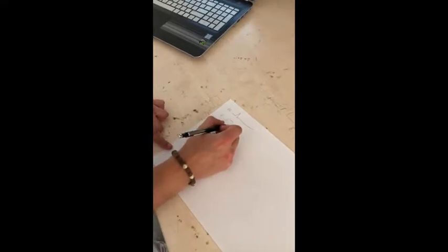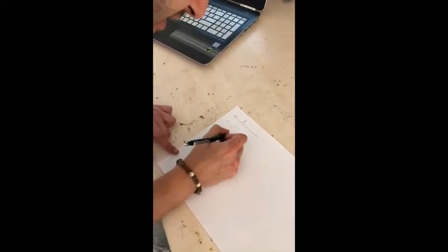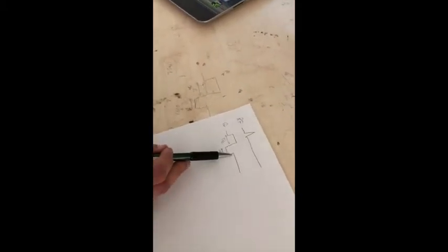For the second part, I would like to show you what I did with the refocusing gradient. Normally, when we give the RF pulse, we set the gradient Gx, and then we give a negative gradient. The book says that this gradient time should be about half of the gradient time. The reason is, if you try to read the signal without giving this negative gradient, the phase dispersion is so large that you can't read the signal. The signal power is too weak.